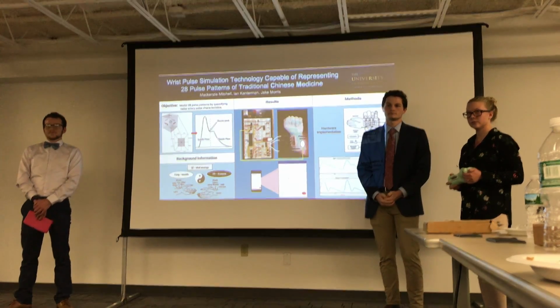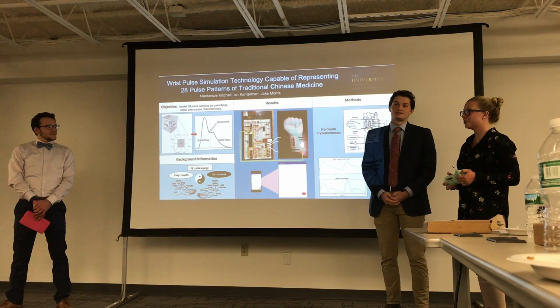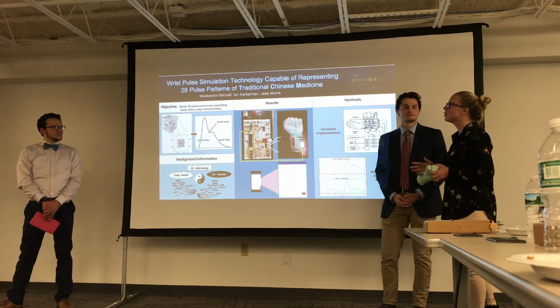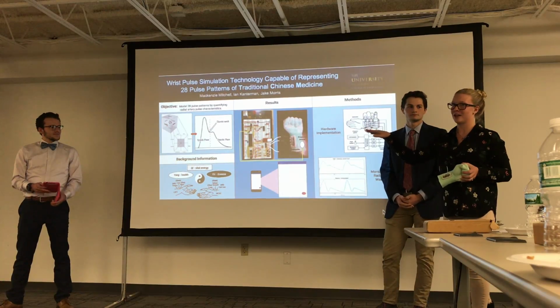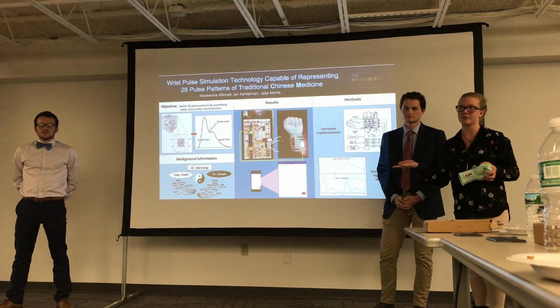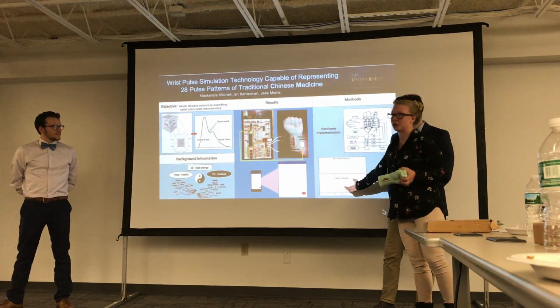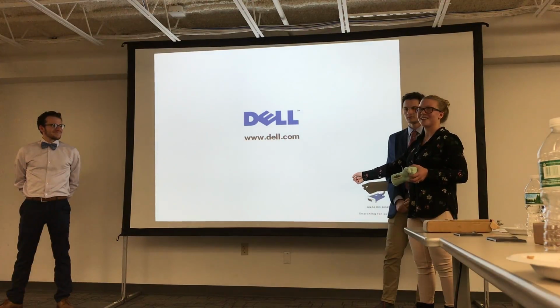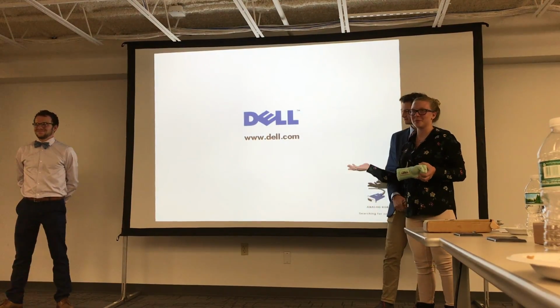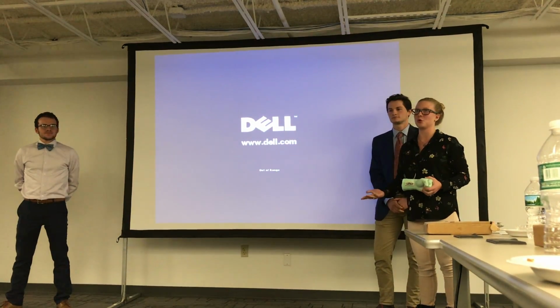Give us an example. What was the most difficult pattern to implement? We have so far worked on modeling the 8 different characteristics, and then we're going to use those and combine them to make the more difficult ones. For example, this one is purely qualitative. That one's called slippery, and all they give for a description is rolling pearls. It feels like it's rolling pearls.